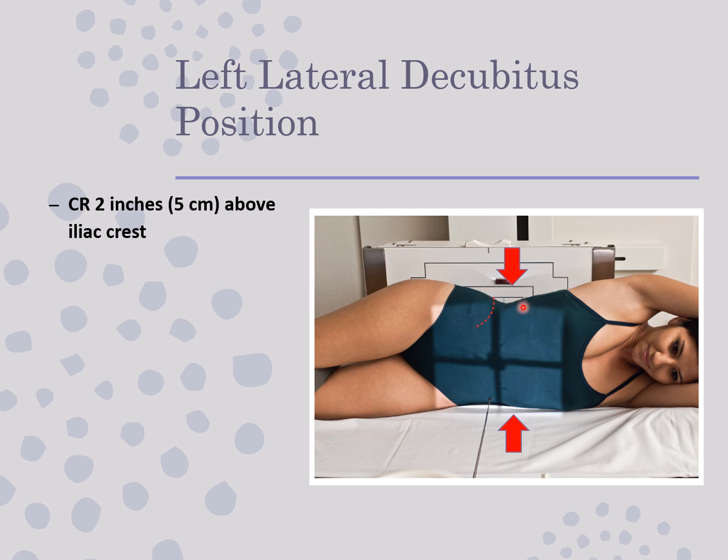The technical factors for abdomen are still 40 inches, a 14 by 17 IR placed either portrait or landscape to the patient. Totally depends on how you would image that patient supine. You would do the same thing for this. So they would do her supine, and now they have this IR. It's portrait to the patient, but it looks landscape to us. The technique for this would be 80 at 12.5.